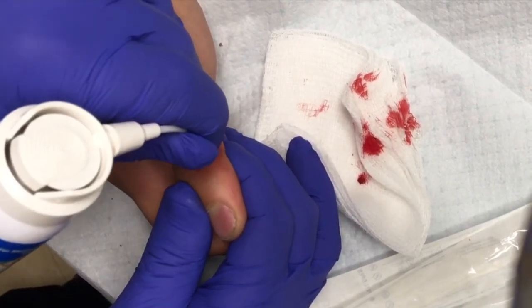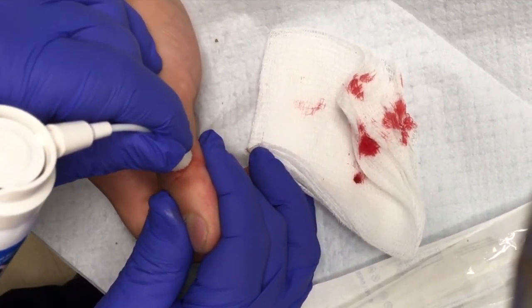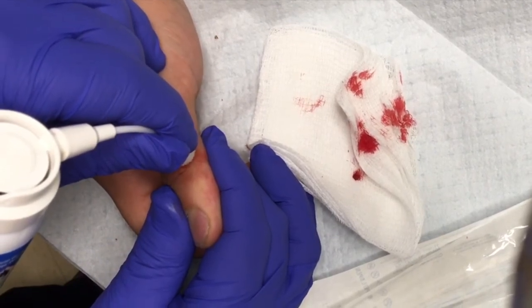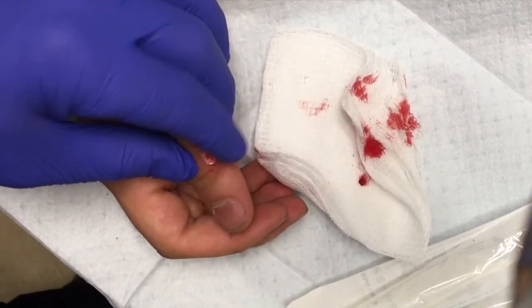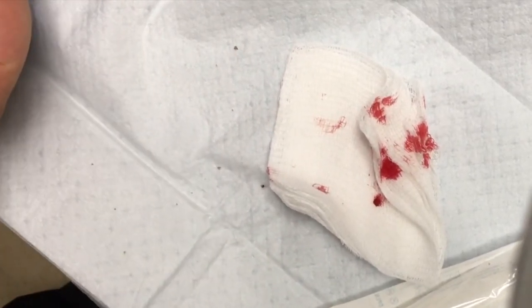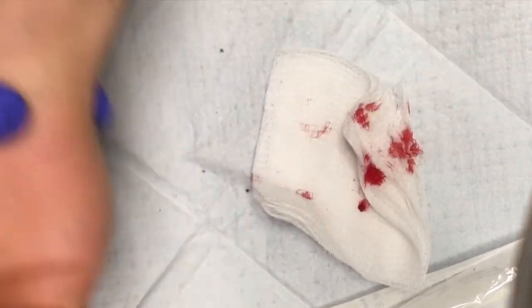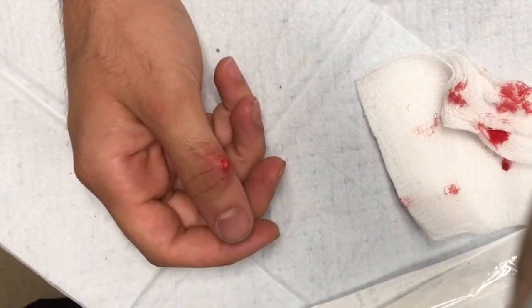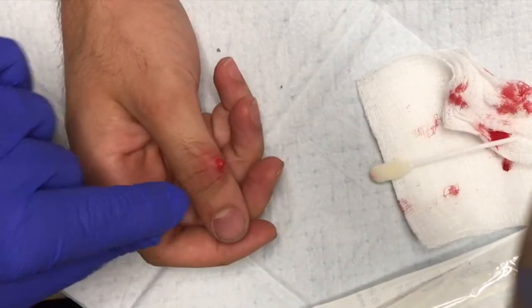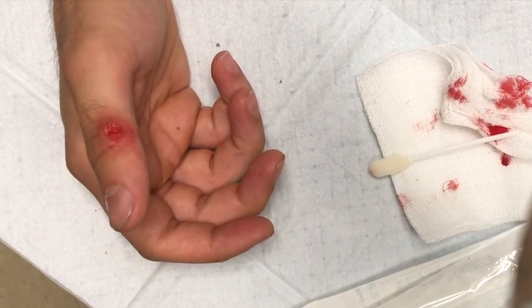This is going to feel like a burn afterwards. I have a seven-year-old — it's like the ice-and-salt challenge, like how long you can keep it on your skin. I just kept going and it made a hole — right here, that's from an ice cube literally right there. So did you win the challenge? Yeah, I just kept going. Alright, that's going to hurt — I won't mince words. I do feel this thing.